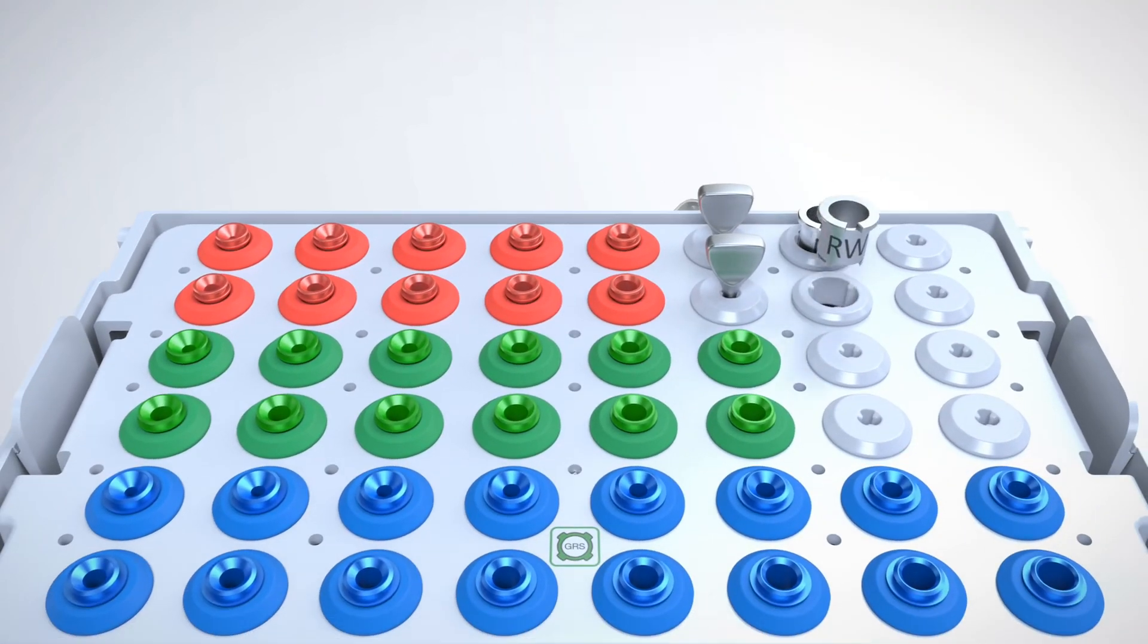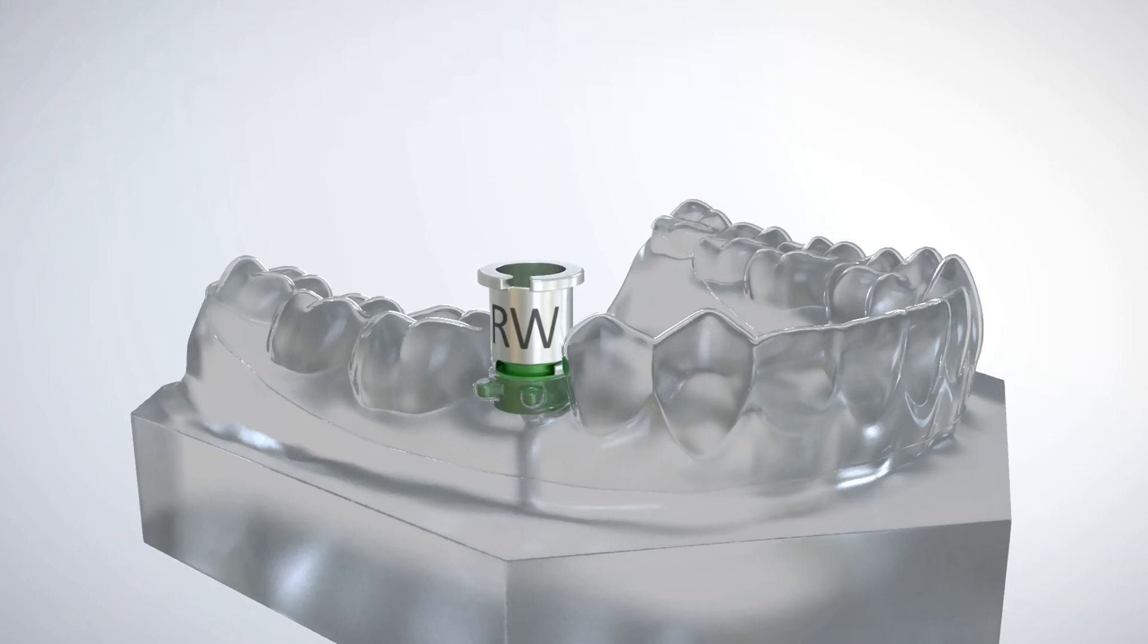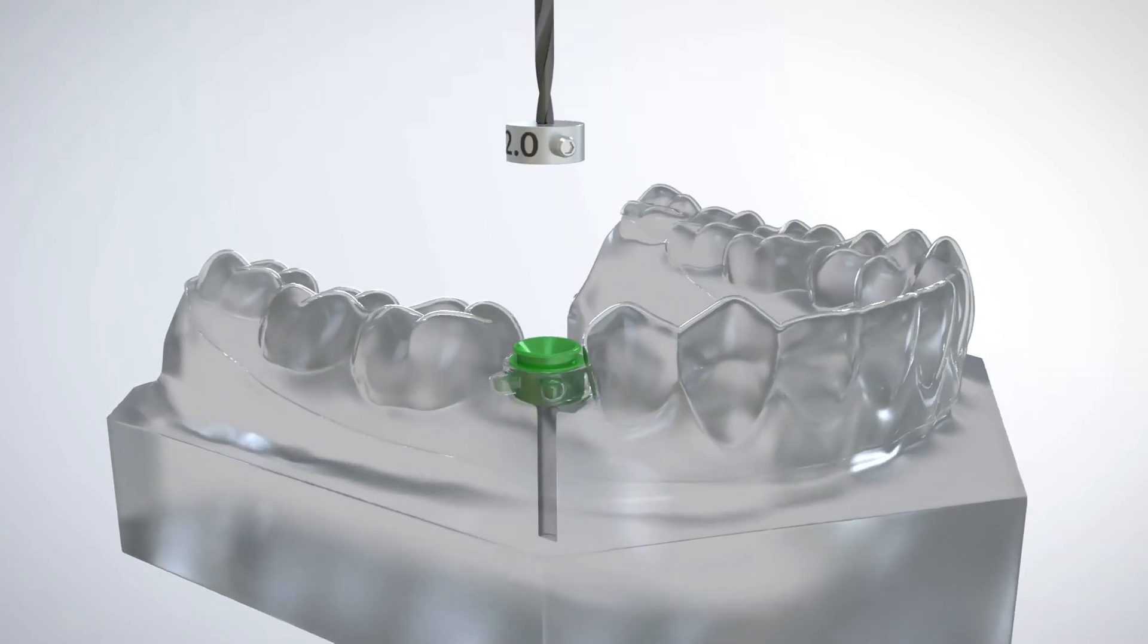A GRS drill sleeve is removed from the cassette using the GRS IR tool. The drill sleeve is then snapped into the surgical guide and the IR tool simply separates from the drill sleeve using a sliding motion.